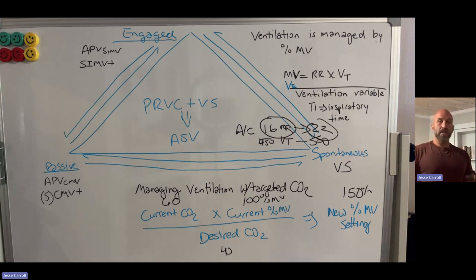And secondarily, something that we overlook way too often is the workload and the cognitive load that this has on the medic or on the rescuer. If they are taking the time to conventionally ventilate a patient during patient transport, they are limited in their capacity to address lines, to address the cardiac monitor, to chart, to safely belt and buckle themselves in the back of an ambulance and manage the patient appropriately.